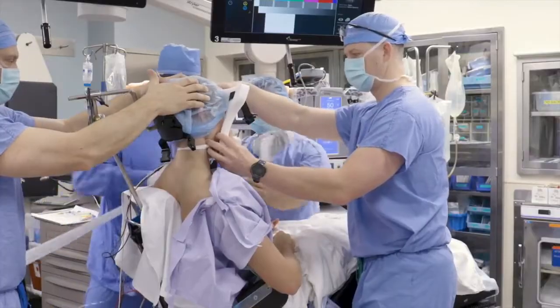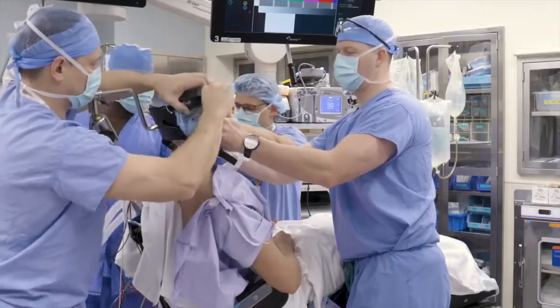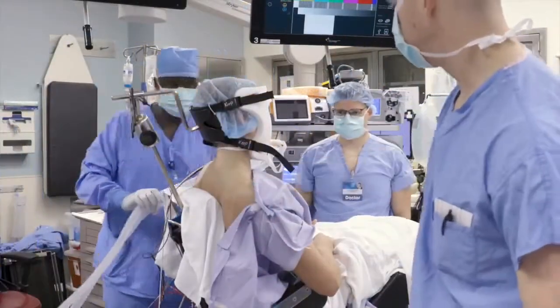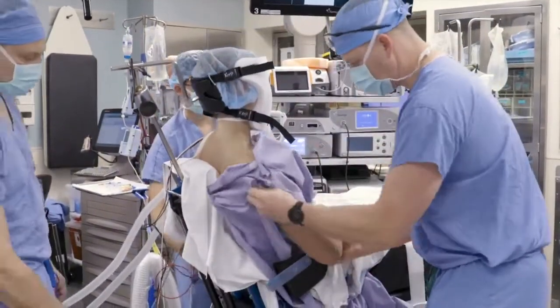This particular beach chair allows for the back rest to be slid away from the operative site in order to allow the entire scapula to be free of the back of the bed. We double check our trunk, head, and neck alignment and make sure the medial border of the scapula remains free.